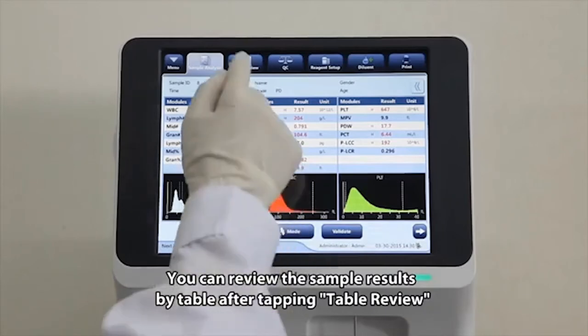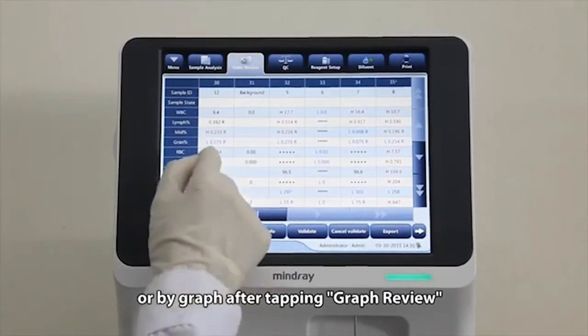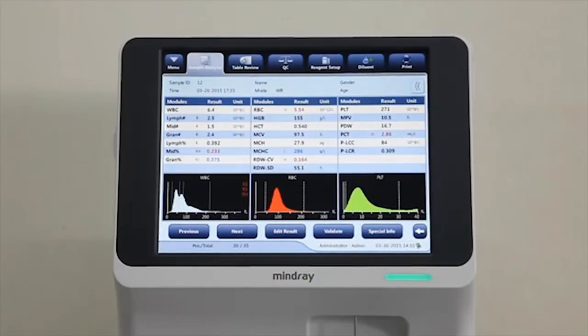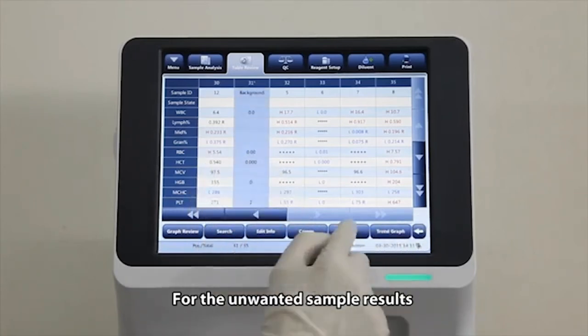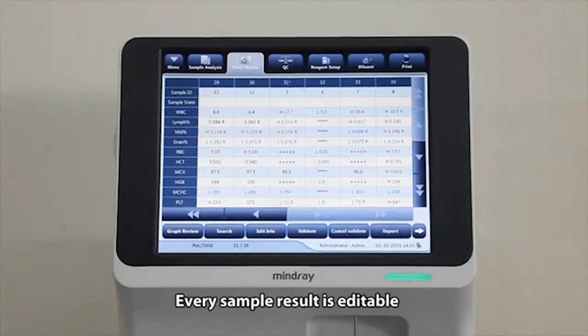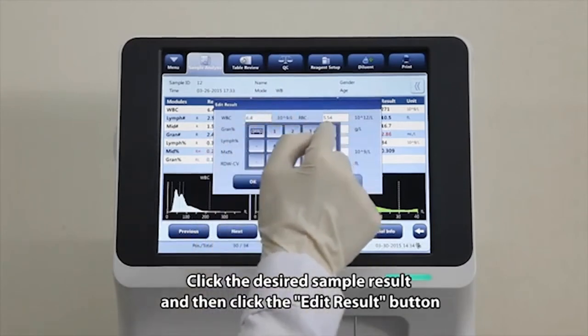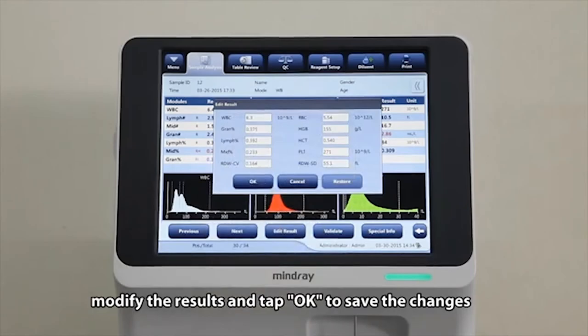You can review the sample results by table after tapping Table Review, or in graphs by tapping Graph Review. For the unwanted sample results, select and tap Delete. Every sample result is editable. Click the desired sample result and then click the Edit Result button. Modify the results and tap OK to save the changes.